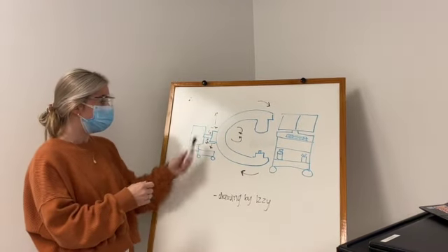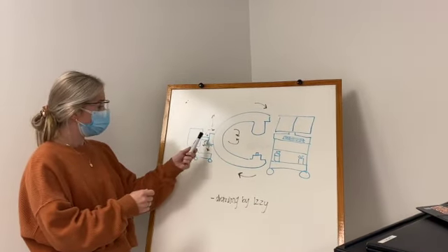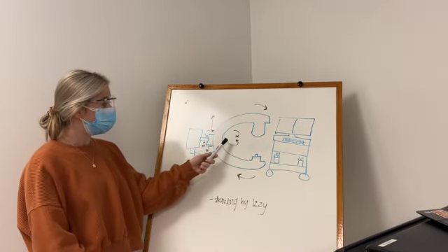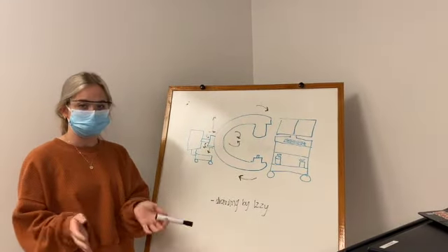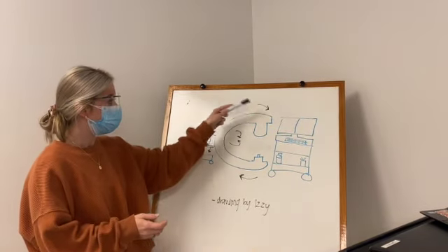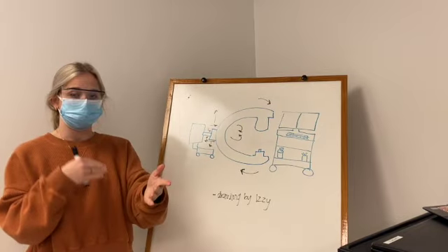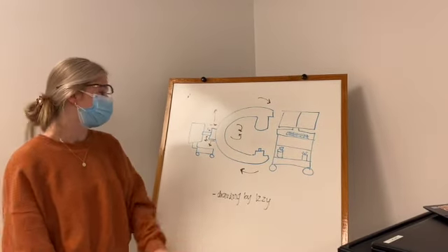You can move it up and down in height. This is your wig-wag, which moves it from left to right. You can also move it proximal and distal across the part that you're imaging. And then these are going to move it from your AP to your lateral so that you can get the lateral view of the structure you're imaging.